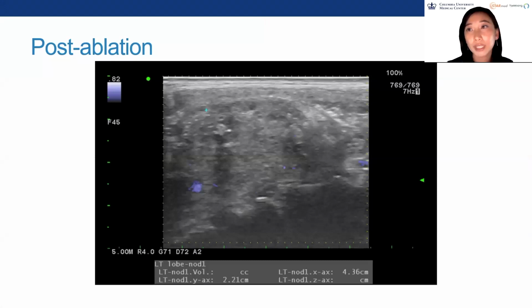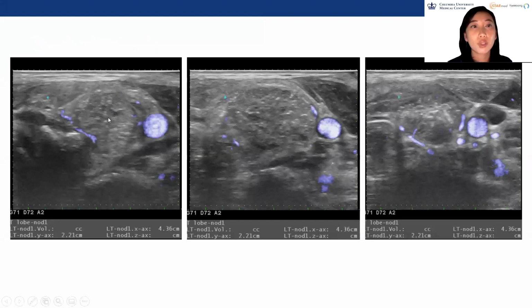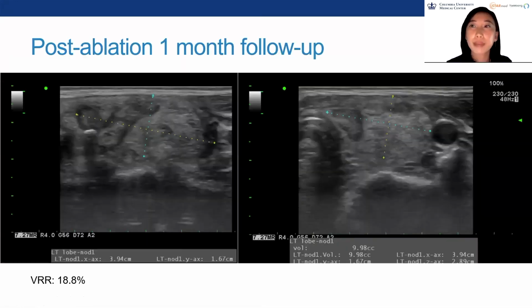This is a post-ablation sagittal view. So you can see that it shows the very typical post-ablation hypoechoic changes. I think I'm a little different in that I start in the superior pole first and work my way down. So the inferior pole is much more hypoechogenic than the superior pole. But you can see from the transverse views that superior, again, mid to inferior, that I thought I had pretty nicely ablated the superior medial feeding vessel. And we had estimated at the time that we had covered about 90 to 95% of this thyroid nodule. So I was very pleased with my very first case. Pat myself on the back.